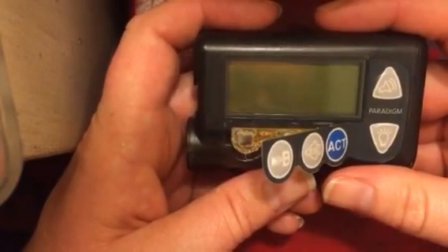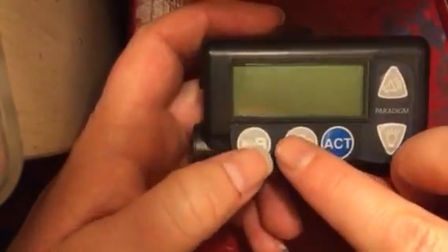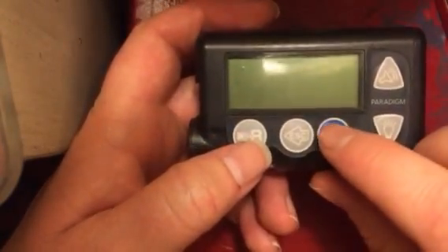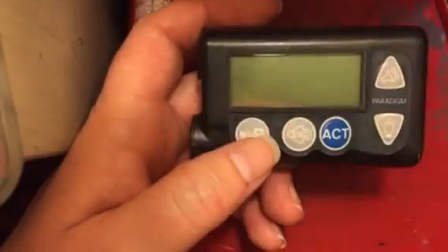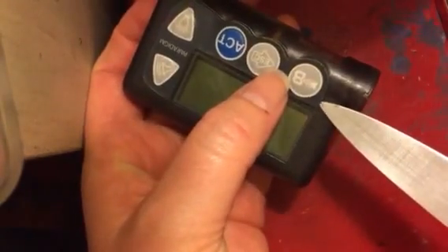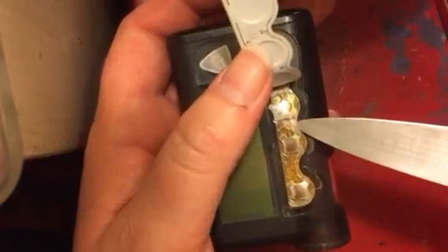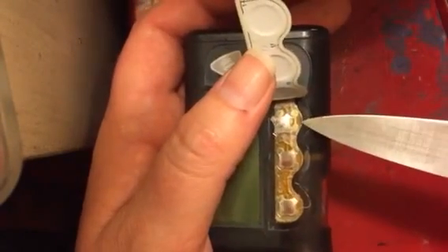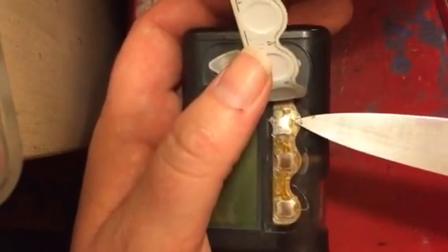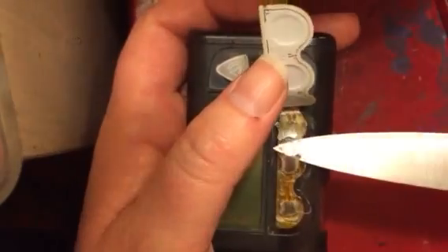So my last ditch effort was to try to take this thing apart and get it working again. I've got a button error and it looked to me like my problem button was my ACT button. This top part is just a sticker basically, so I got a little paring knife and started right under here in the corner and peeled it back. Then I saw this clear piece and gingerly poked right under here and got it to lift just a little bit, and then I realized it's one piece of clear, so we're going to have to take off the whole part.